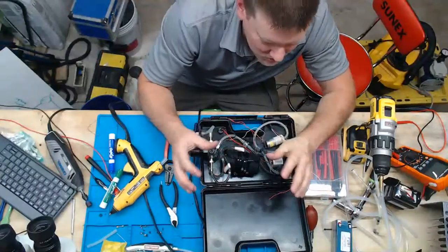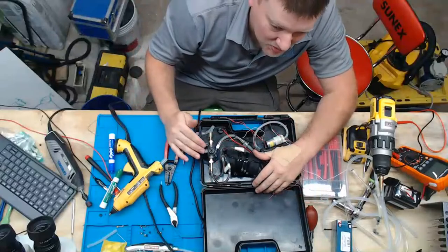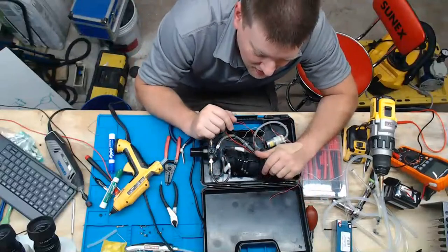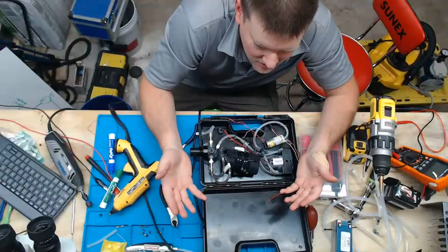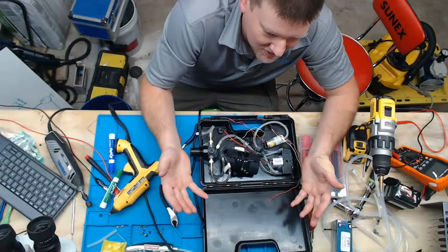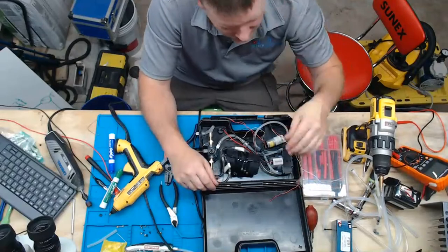You know, it's not like it's machined to tolerance or anything. It's just a stupid regulator. And that same exact regulator I have found on eBay for like $30, $40. But they're selling it to us for $800. So that's when I started getting the idea of this.